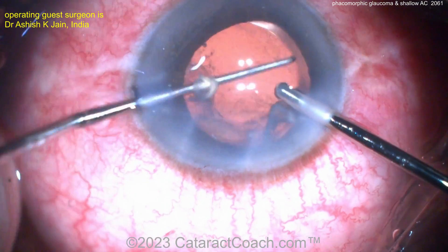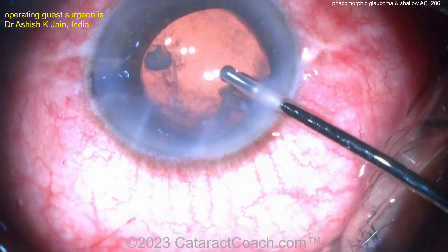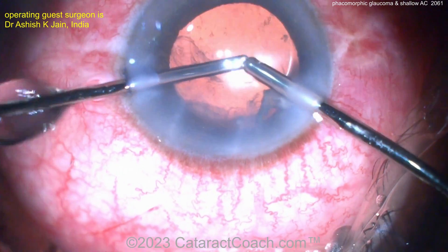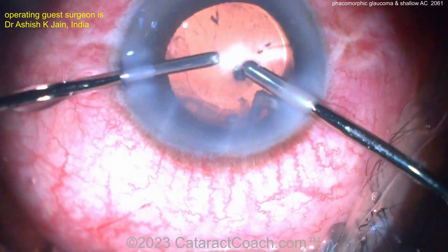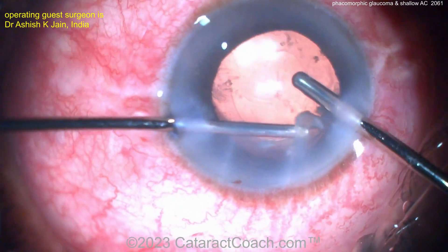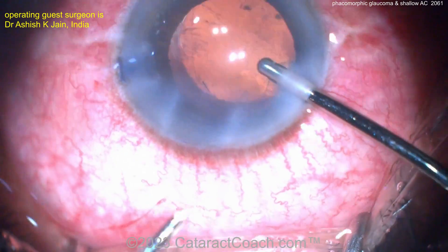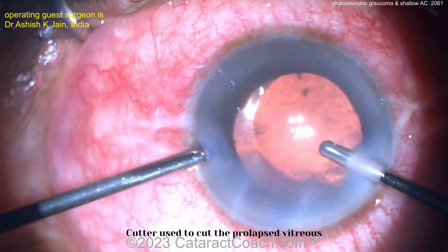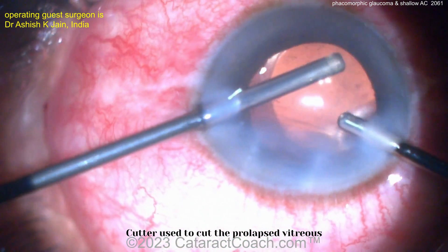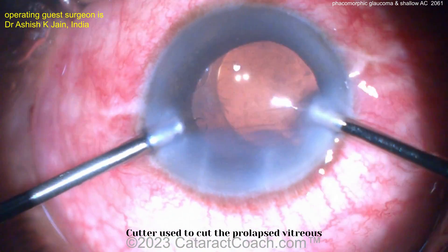Is it in the bag yet? Getting there. You've got to be careful here. It's a little bit of a bulky lens — I would prefer a simpler design, a hydrophobic acrylic lens with smaller, thinner haptics; would have been a lot easier. Cleaning up the rest of that lens material and getting it out of the eye. Now the vitrectomy cutter goes in for the vitreous. Triamcinolone will make it a lot easier. But that's a tough case — very nicely managed.